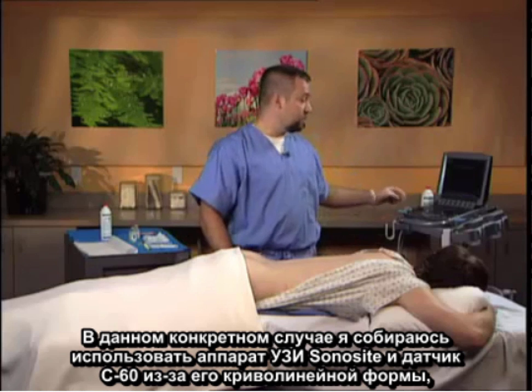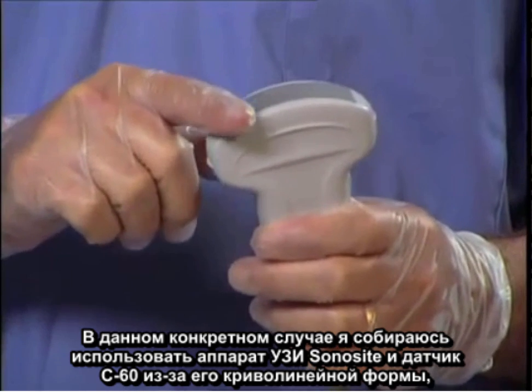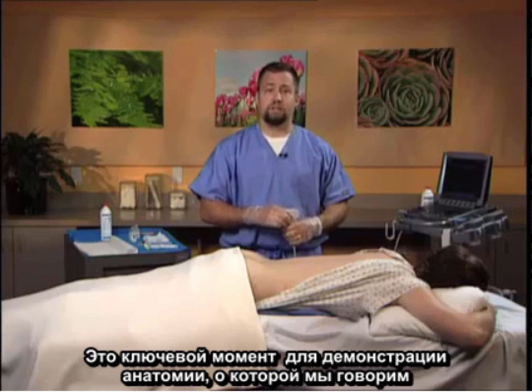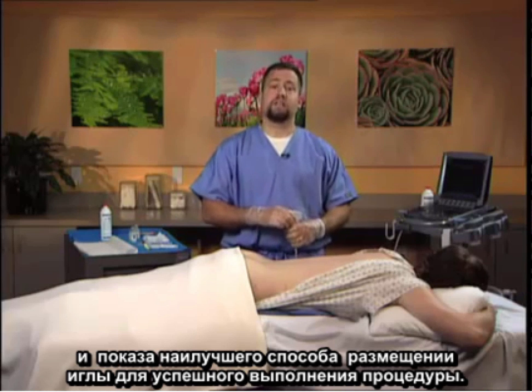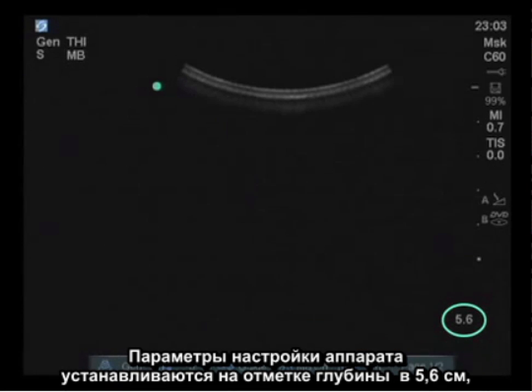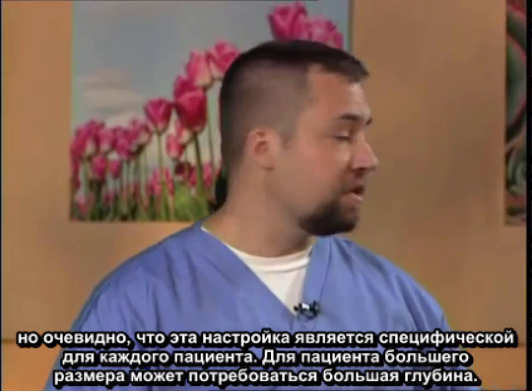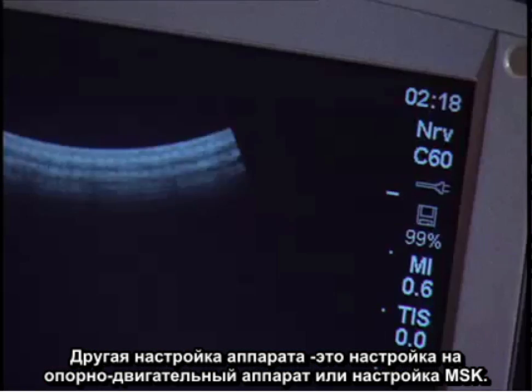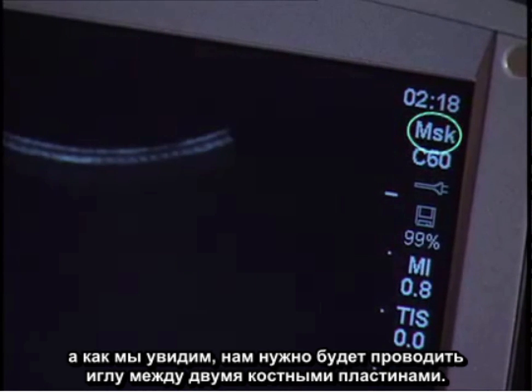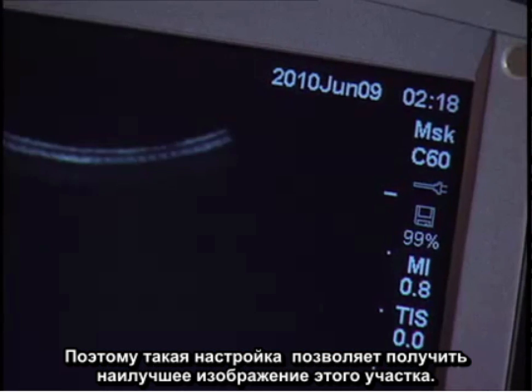In this particular case, I'm going to be using a Sonocyte C60 probe because of its curvilinear shape, which will facilitate viewing of the sacral anatomy. This is key for the demonstration of the relevant anatomy and ultimate placement of the needle for successful completion of the procedure. The settings are set for 5.6 cm depth — obviously this is patient specific, as a larger patient may require a deeper depth. The other setting is the musculoskeletal, or MSK, setting, which provides the best bony enhancement. We'll need to be passing a needle between two bony plates, and this setting facilitates the best view of this.